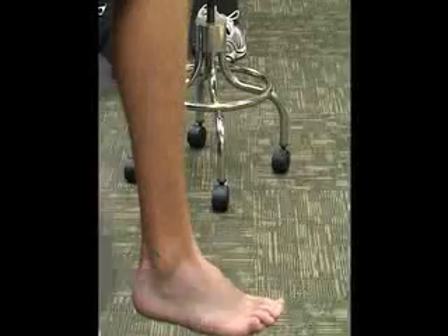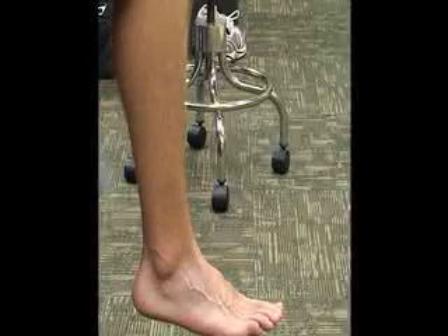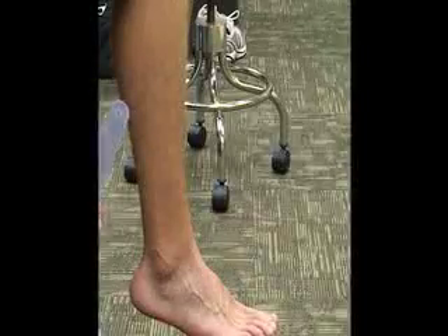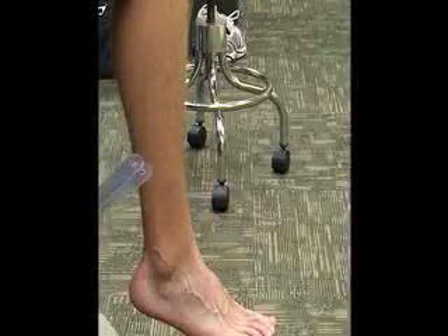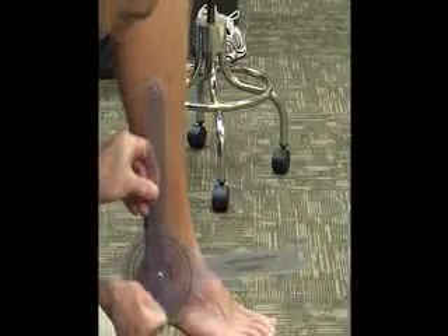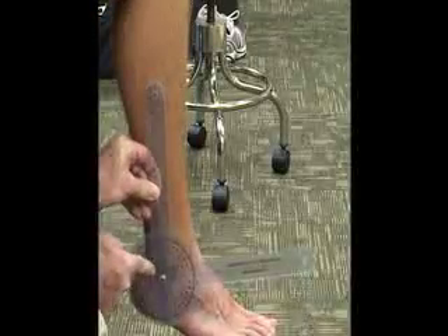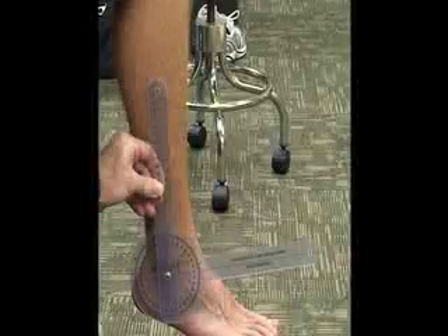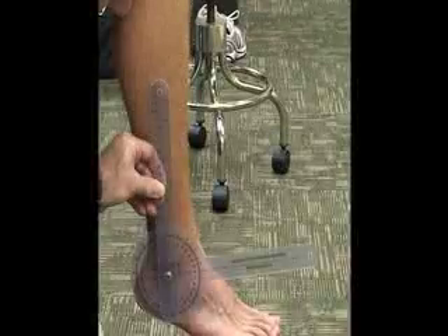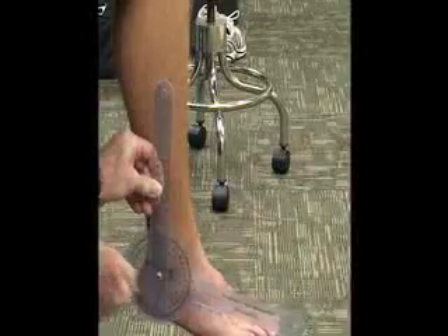We can also do plantar flexion of the talocrural joint. Same position — he's going to be sitting on a table with his knee flexed at 90 degrees and he is at zero degrees of inversion and eversion. Our landmarks are going to be the same, just lateral to the lateral malleolus as your fulcrum. Your stationary arm again is going to be parallel to the fibula on the lateral side, and then the moving arm is going to be in line with the fifth metatarsal bone.